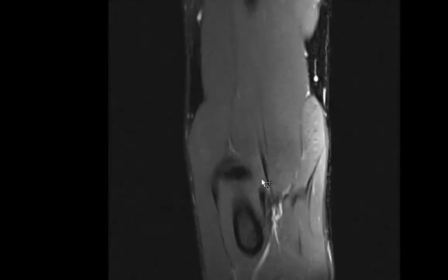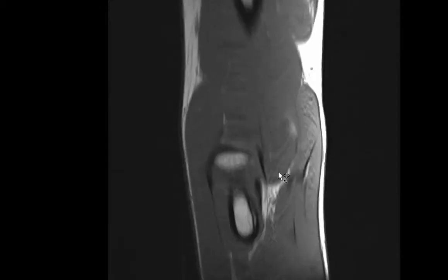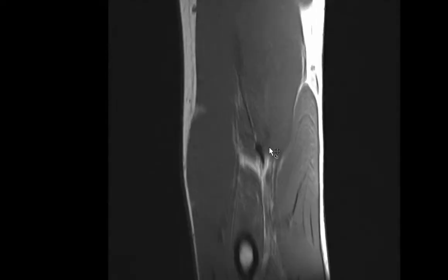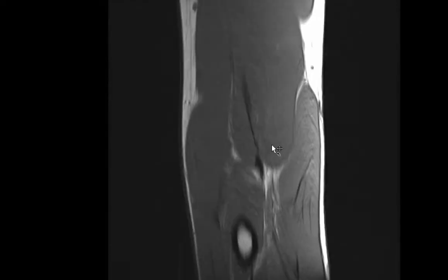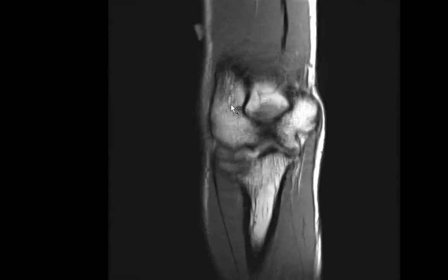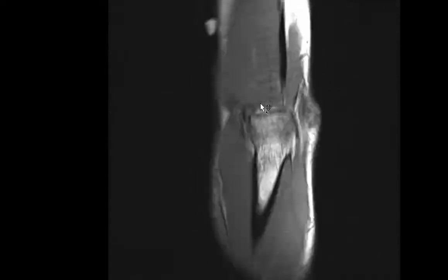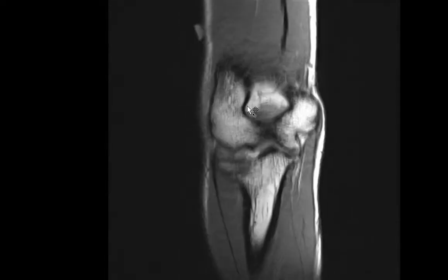To summarize the lateral ligaments: we look at the radial collateral ligament, the lateral ulnar collateral ligament, and the annular ligament, which is sometimes better seen on axial images. I then turn to the coronal T1 weighted image to assess the marrow — making sure there's no hypointense fracture line suggesting an acute fracture, no evidence of avascular necrosis, and no T1 isointense-to-muscle or hypointense-to-muscle signal within the bone suggesting a marrow proliferative or replacing process. I also look at muscular bulk for atrophy or T1 hyperintense signal within the muscle.